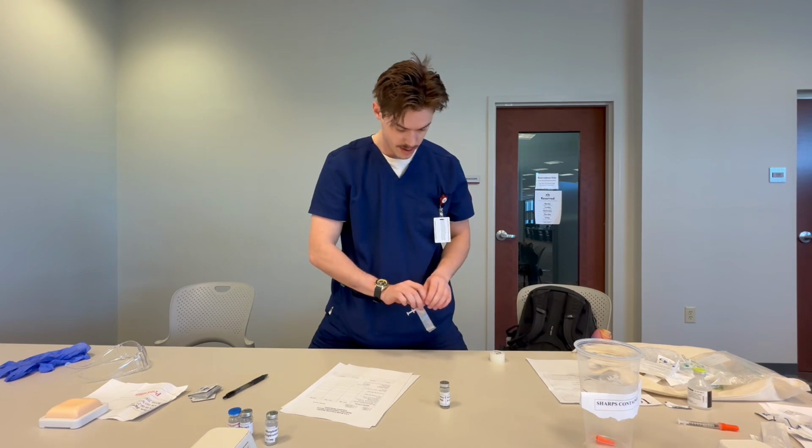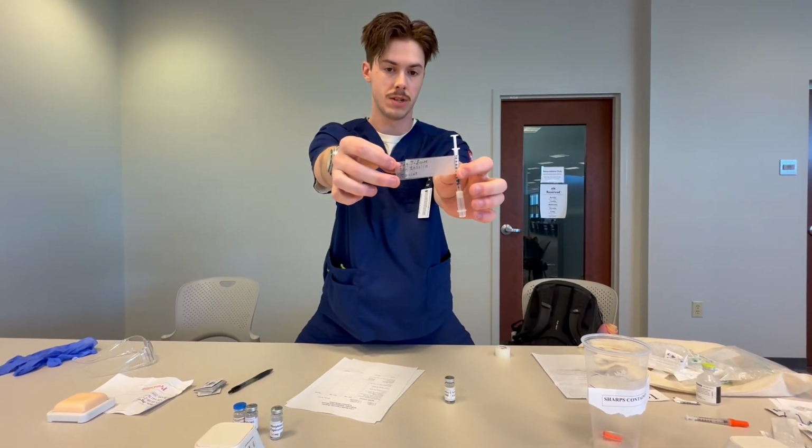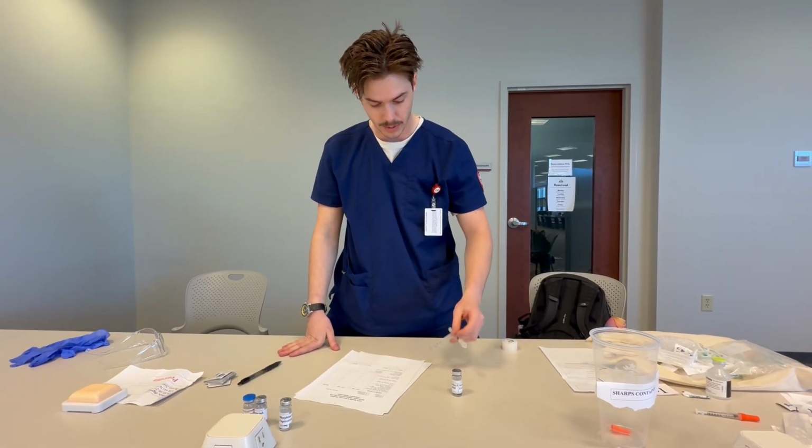And I have here labeled Jaguar J. Jones, regular insulin, 10 units on my label.